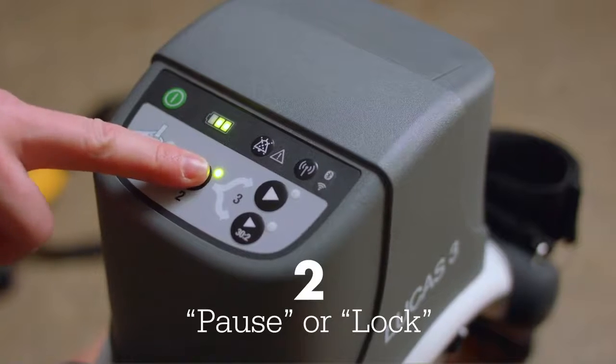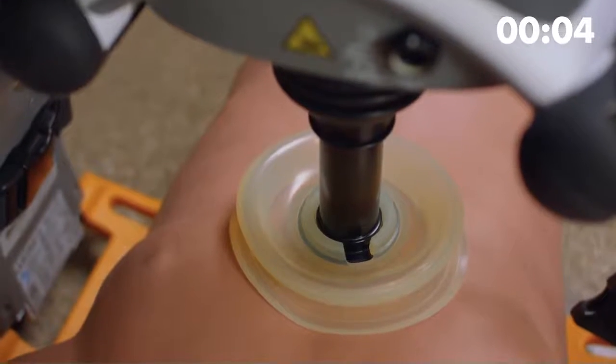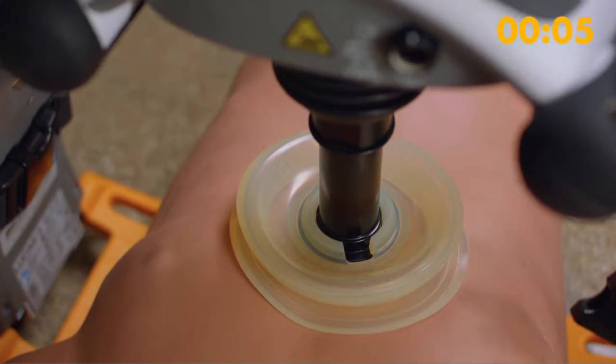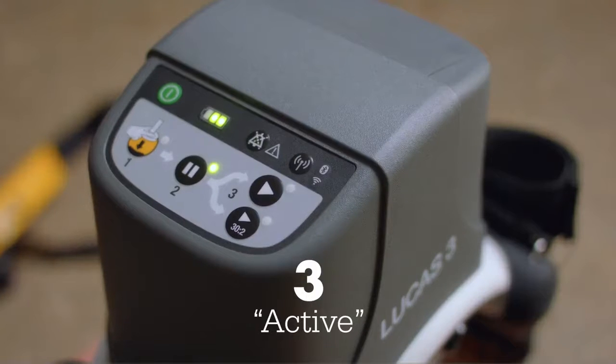Second is the pause or lock indicator. When you press this key, the height position of the suction cup is fine-tuned and locked into the start position to ensure proper compression depth. This is the second hands-off moment. If coordinated well, this should only create a few seconds off the chest. The third indicator, active, starts compressions.